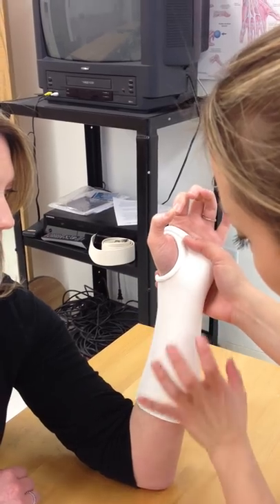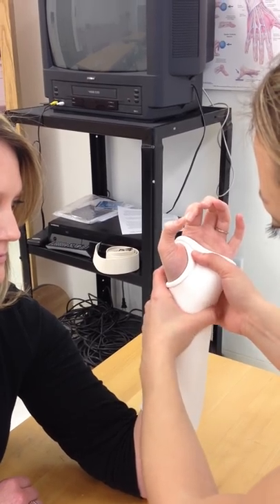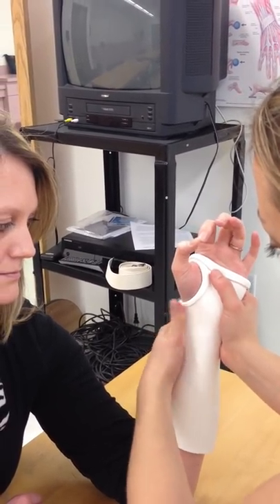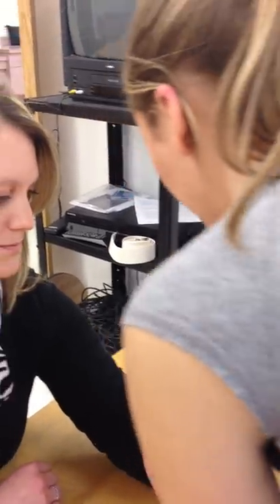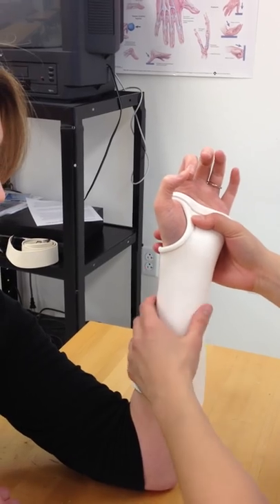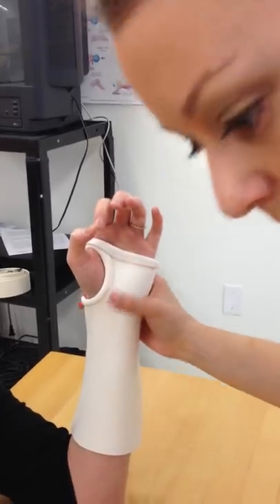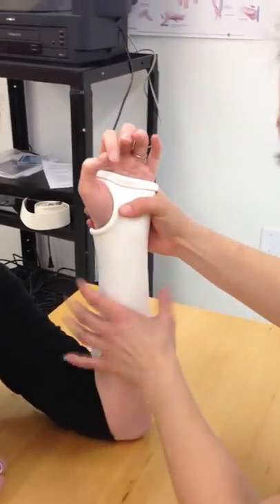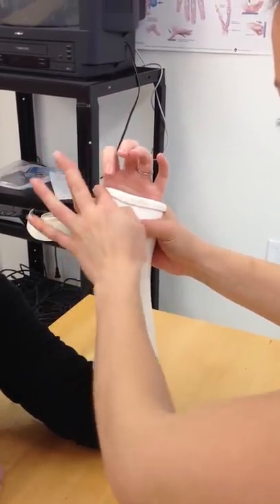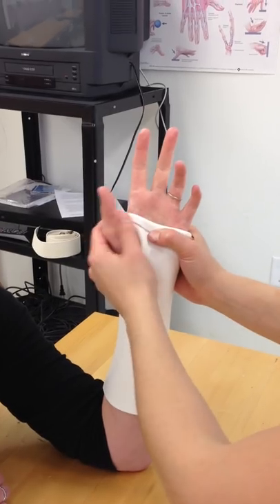Don't let it move. If you twist this, your measurement of width is going to be way off. Make sure you aren't really pulling on that material. Just let it harden. You don't want it too thick in here — it's going to rub your patient. Don't let it go above the creases there either, because then it's going to rub them.